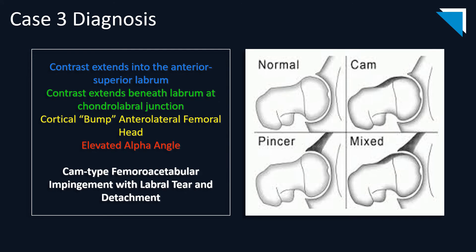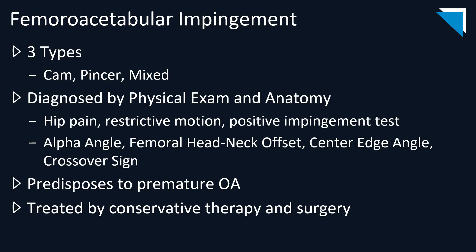This is CAM-type femoroacetabular impingement with a labral tear and detachment. There are three types of femoroacetabular impingement: CAM type, which involves the femoral head-neck junction; pincer type, which involves acetabular overhanging; and mixed type, which is very common. This is diagnosed by physical exam and anatomy. Patients present with hip pain, restrictive motion, and a positive impingement test. Measurements include the alpha angle, femoral head-neck offset, center edge angle, and the crossover sign.